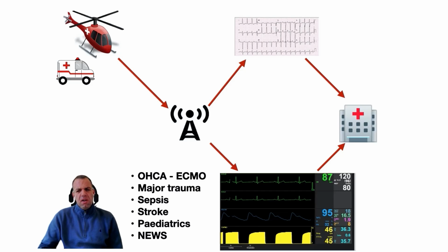So then being able to follow the patient in real time, see them coming towards you, and look at parameters, for example, like their end-tidal carbon dioxide, will allow them to make a much more informed decision about how viable this patient is, whether ECMO is likely to be successful.